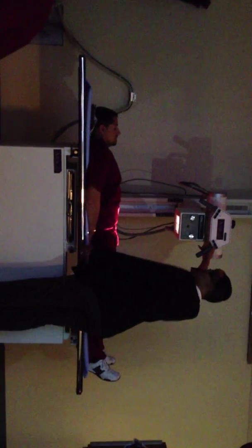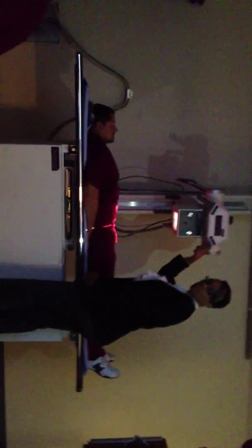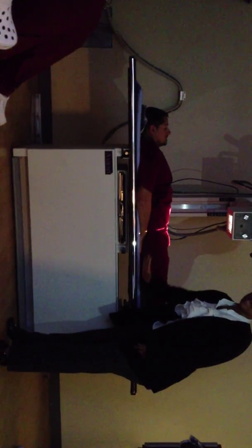We want to use cassette because we're in the Bucky, so we need to be at 40 SID. We don't use table because table means our image receptor is sitting here, and there's a 3 to 4 inch difference between the table and the Bucky.